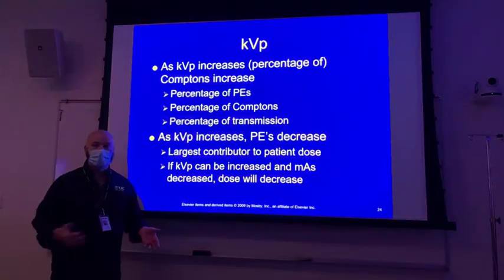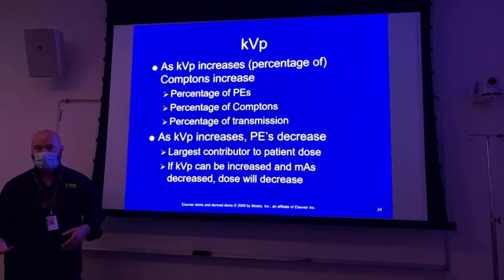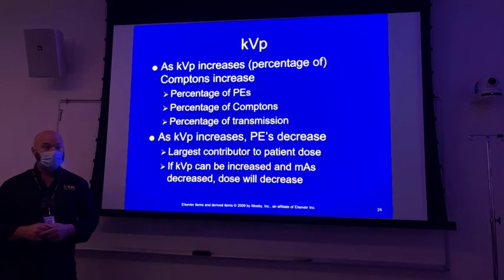So if you push that, it disengaged the motor and you could push it a whole lot easier. And it was still hard to push. Okay, it's like pushing a car. You ever been standing on the elevator when somebody comes on with a portable? What does it do? Right.